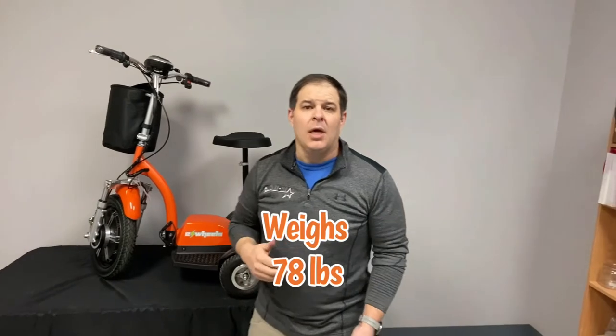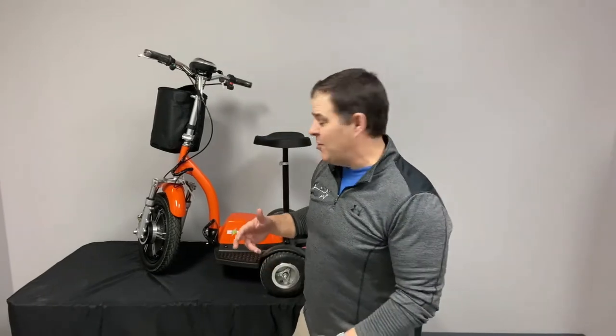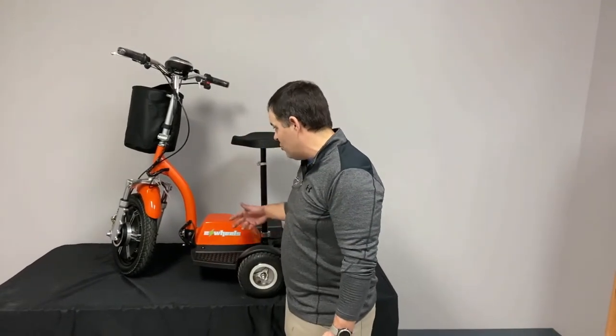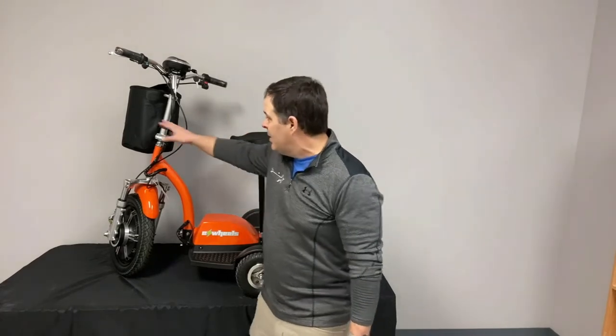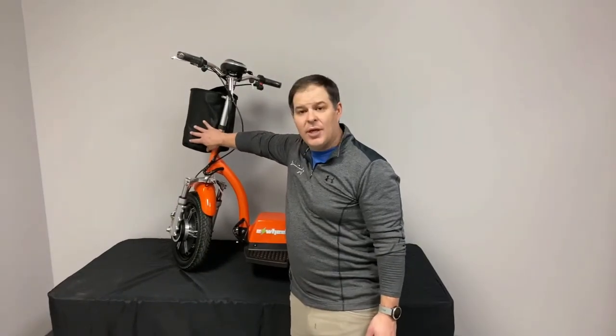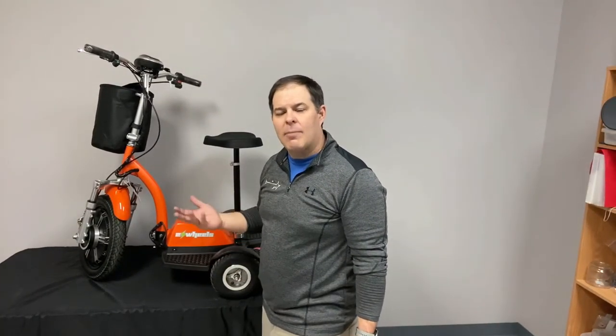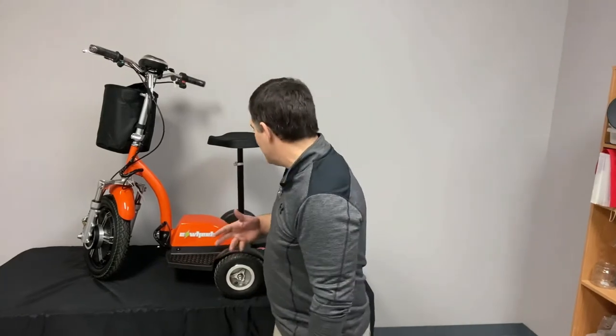It weighs 78 pounds, 80 pounds shipped. It actually comes to you ready to go. All you really have to do is cut a couple of straps where it's tied onto the pallet, take it off, put the key in, put the basket up front, and you're ready to go. We do recommend charging it all night before you use it, but if you drove around for a few minutes first, not a big deal.